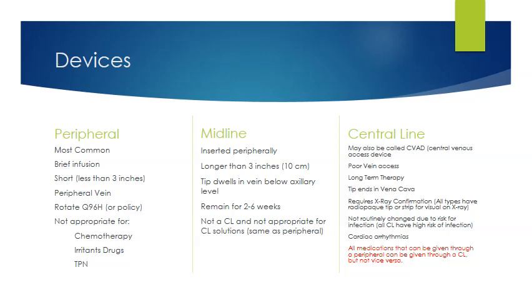Central lines may also be called CVAD. That stands for Central Venous Access Device. I think most people still refer to them as central lines, but I want you to know that terminology is out there. Many central line devices have particular specifications, so you want to make sure that you're following your policy regarding whatever the regulation is for that specific device.